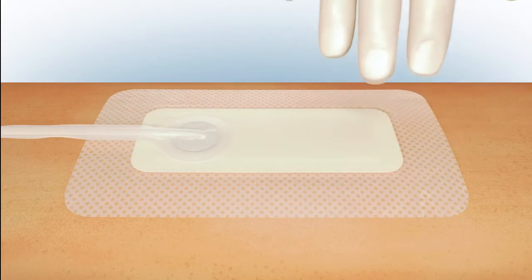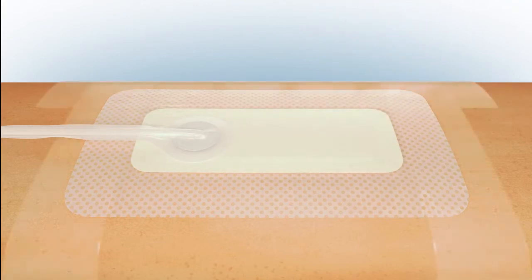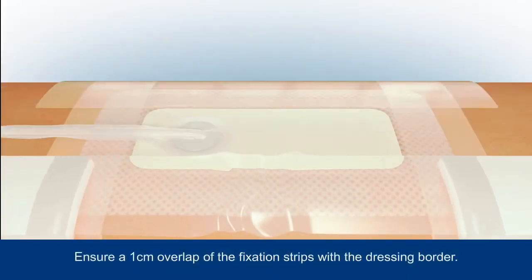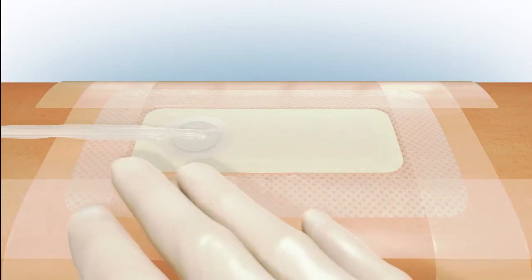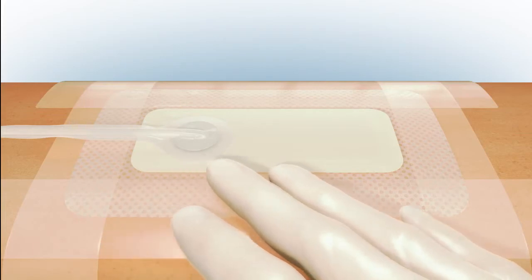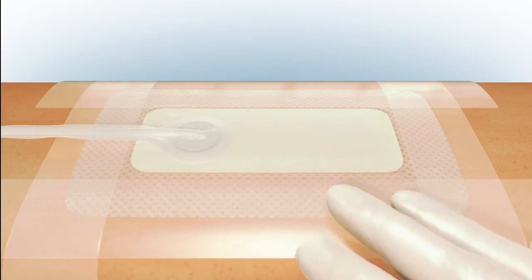In order to maintain a good seal during the wear time of the dressing, apply the fixation strips with a 1 cm overlap to each side of the dressing. Smooth the strips to ensure an effective seal. Be sure not to trap the tubing.